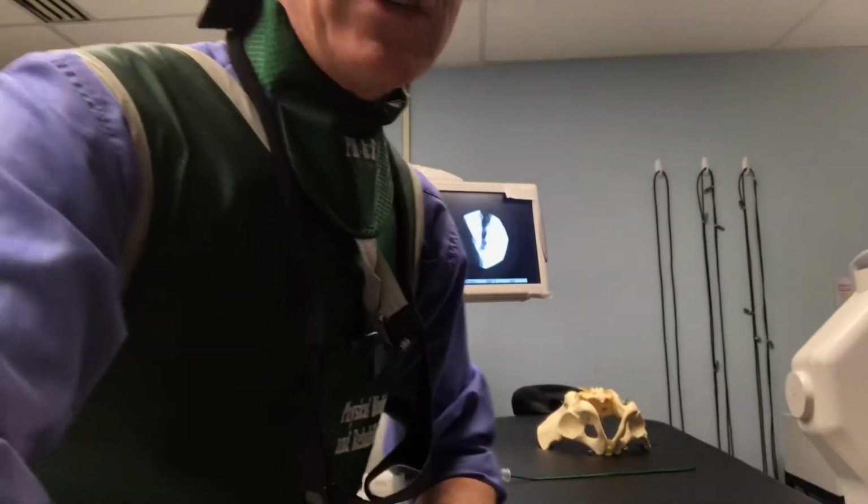It's unfortunate for many patients that have injections done by physicians that are not as familiar with treating the tailbone, and either they do the injection blind, or even if they're using fluoroscopy, because they have not identified the abnormality, they're using the fluoroscopy to inject someplace on the coccyx, but often it's not the place where the person actually has their abnormality or actually needs the injection.